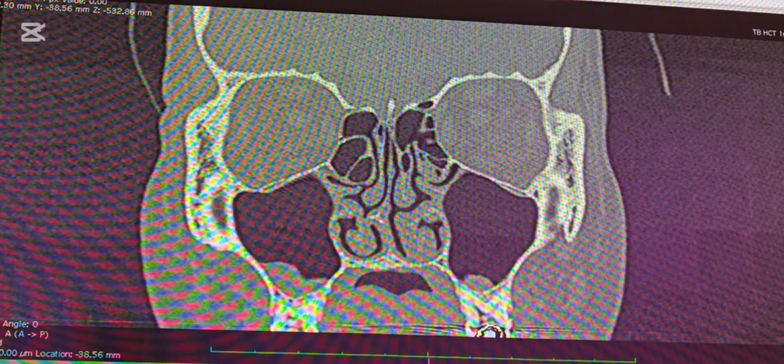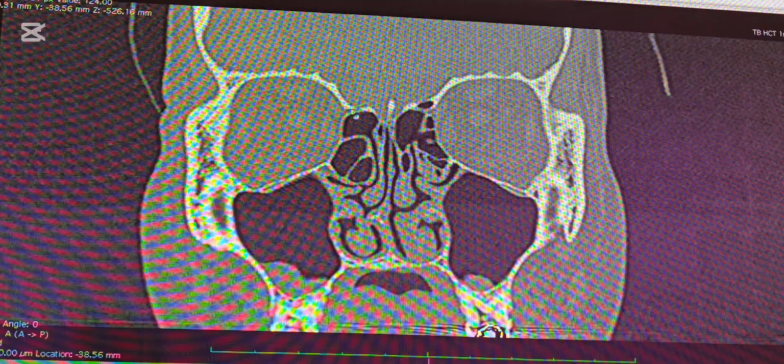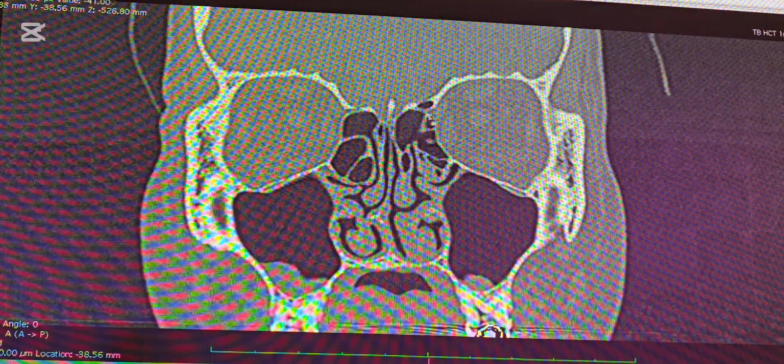Anterior ethmoidal artery. So here, the anterior ethmoid is almost nearer to the level of the roof. So it's very difficult to injure unless you injure the cribriform plate itself, fovea ethmoidalis, right? So that is the anterior ethmoidal artery. You can see clearly on both sides.